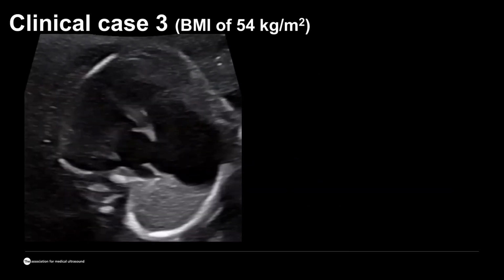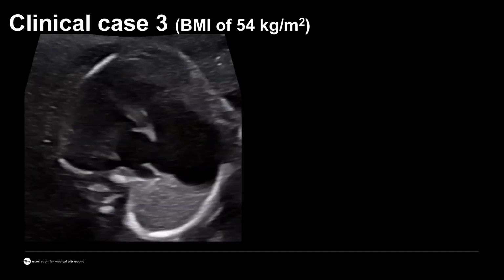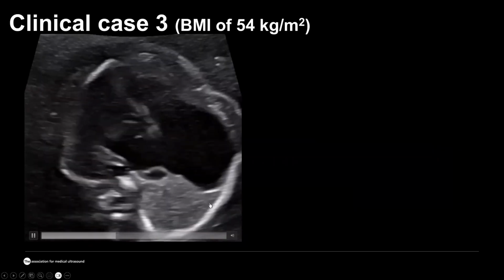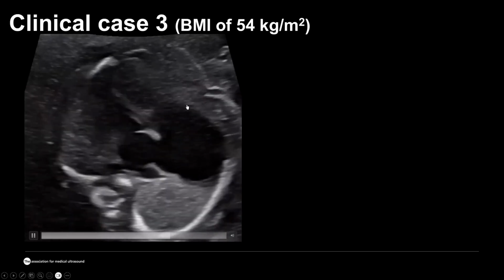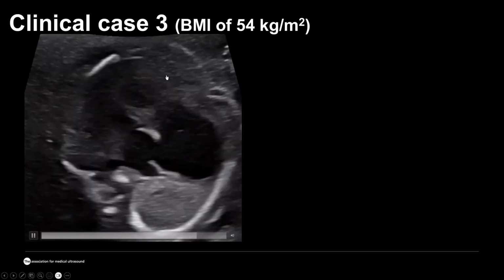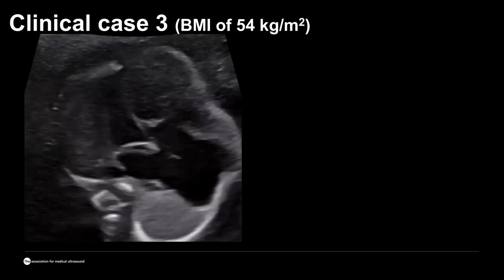So the other challenging situation, the BMI of the mom is 54. And you may say that, well, this is not that bad. So the image is really looking okay for this type of challenge. And at least it helps us, like shows us very vividly that this is a major cardiac anomaly.